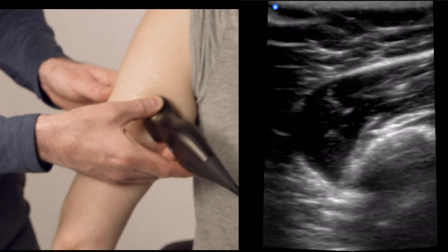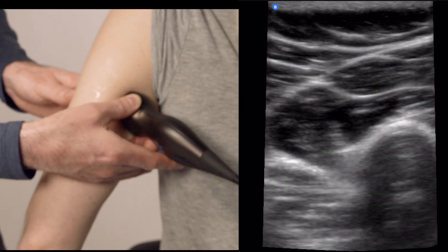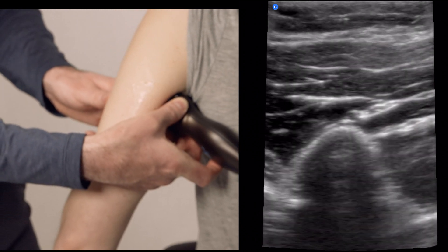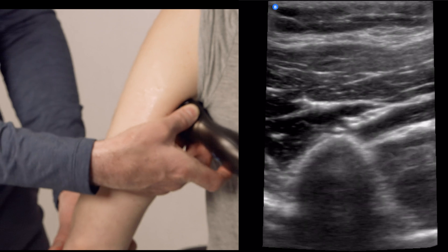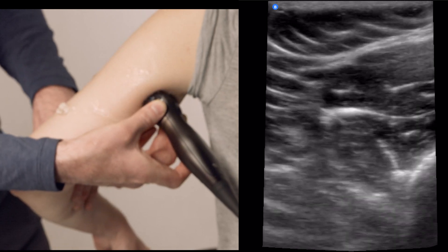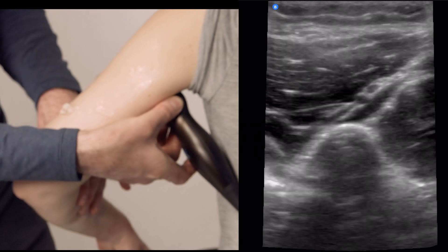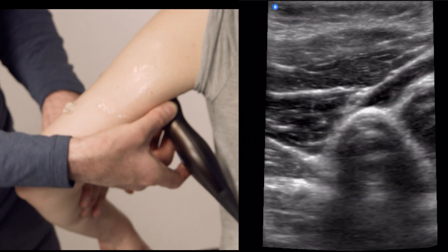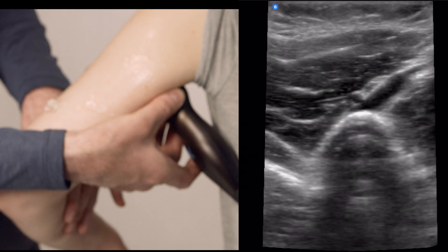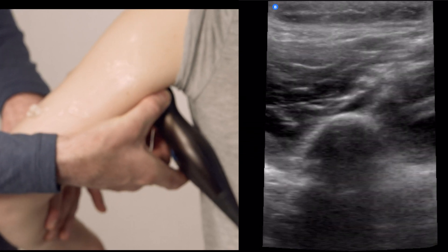Here is the nerve as we're coming around posteriorly. You can see that without abducting the arm, we really get stuck because the transducer is going to hit against the thorax. So you're going to have to abduct the arm as you come proximal. At the proximal portion of the humerus, the radial nerve leaves the humerus itself and goes up to the cords of the brachial plexus.